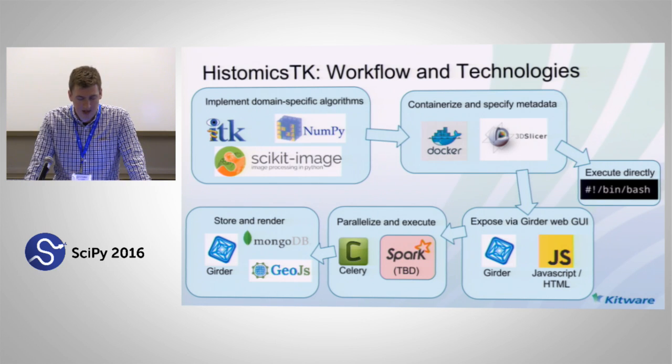And those algorithms can be executed directly, or they can be loaded into Girder and exposed via the web, and then run interactively by a user. And then once a user basically selects the parameters that they want, the execution is kicked off. Currently, it's using Celery. It can run remotely or on the same machine. But we'd like to move to something that is either based on Hadoop or Apache Spark or something else if we want to do true batch processing with data locality and all those nice things. And then the final component here is to look at the results and either render them on the screen or output them for future analysis, or even pipeline together multiple stages of an algorithm. Maybe you're going to run a feature extraction on individual images, and you have another algorithm which takes all this aggregated data and pulls it together.